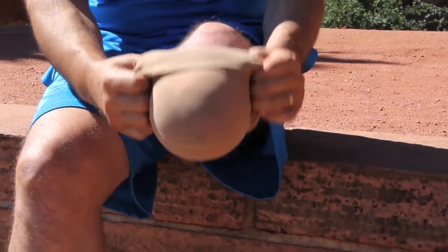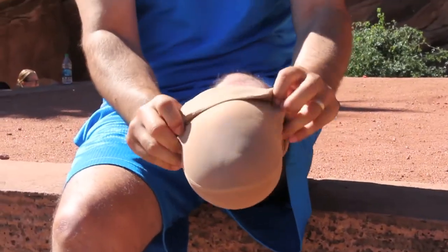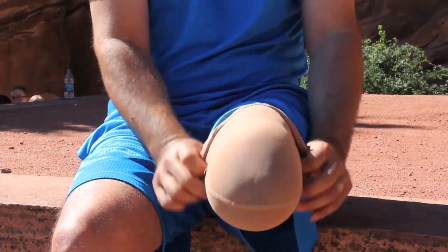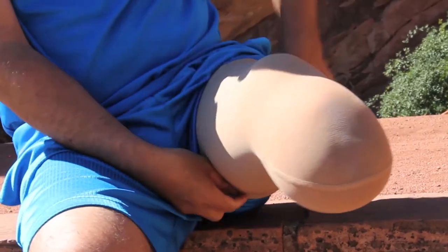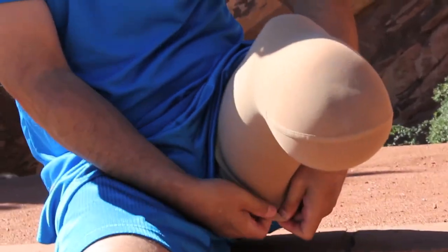The shrinker should be very snug. Make sure the shrinker is pulled taut with no wrinkles. The shrinker must be pulled up all of the way at all times. This may require you to pull up the shrinker several times throughout a day to keep it snug.